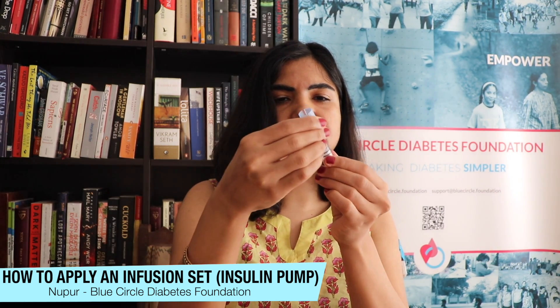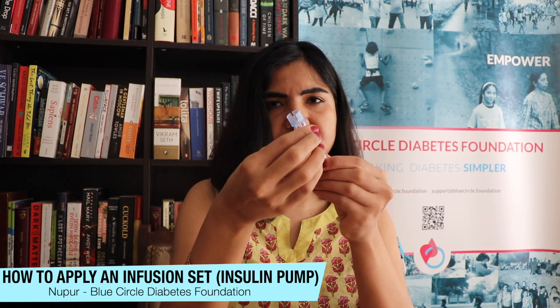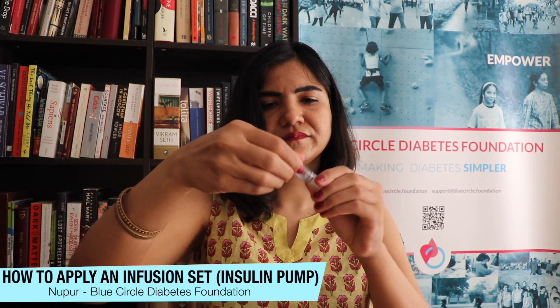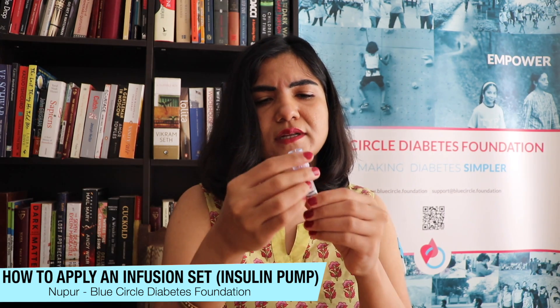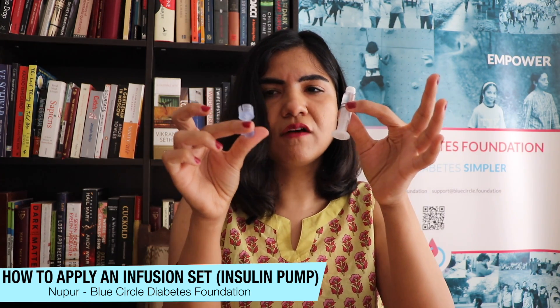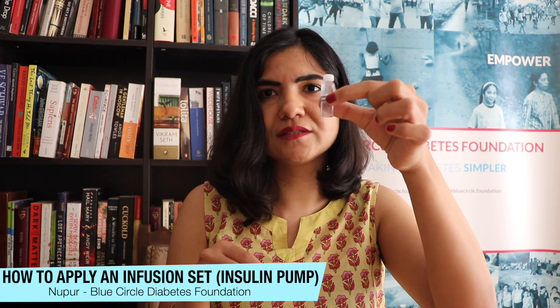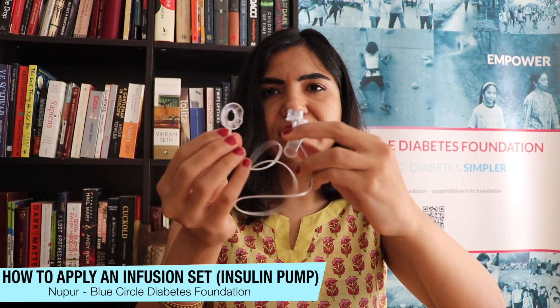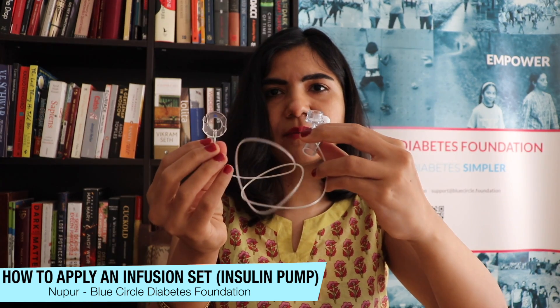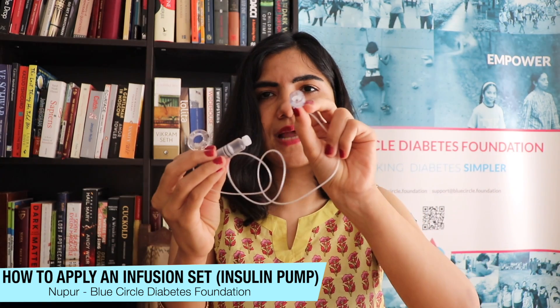Here's my reservoir. I'm going to push out a small drop of insulin, take off both the top and the bottom caps, and then this reservoir is going to go into my insulin pump. The tubing has two ends — you can see which one connects to the reservoir. I'll use that end and plug it into the reservoir; it has a little needle that goes right in.